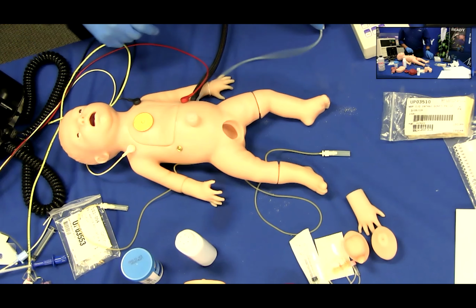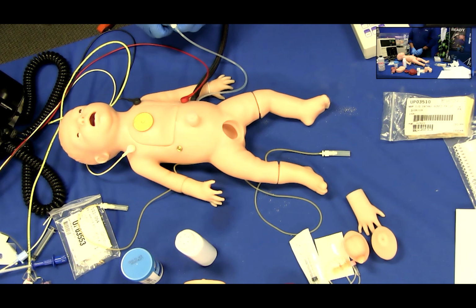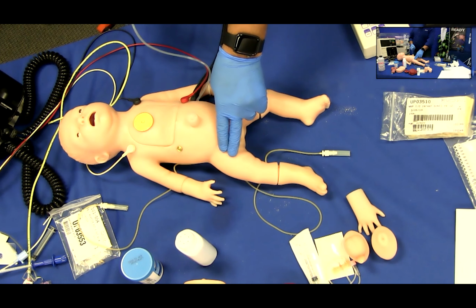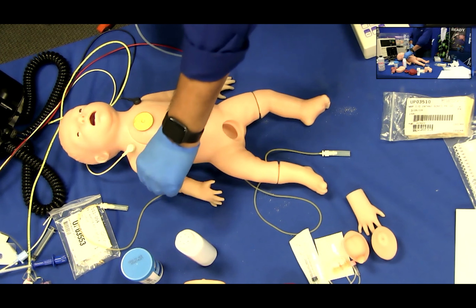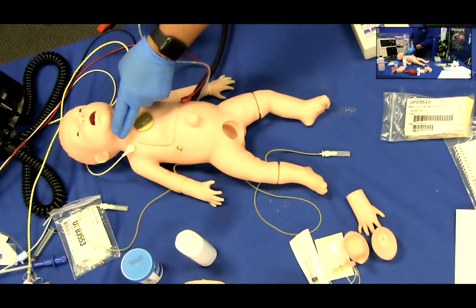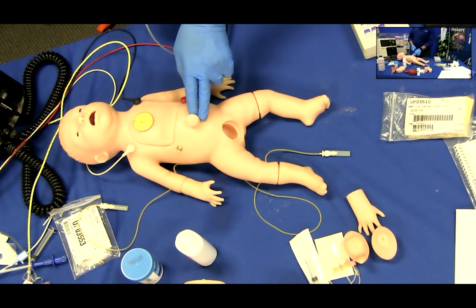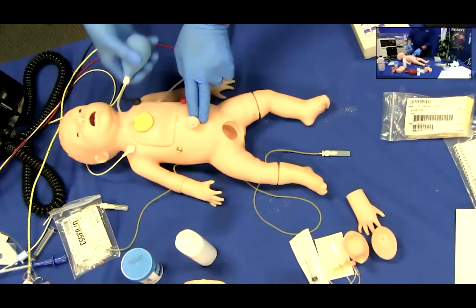Pulses. C.H.A.R.L.I.E features 7 functioning pulse sites: the right femoral, the left femoral, the right brachial, the left brachial, the right carotid, the left carotid, and the umbilical stump. The pulses are manual and can be simulated by attaching the squeeze bulb to the site and squeezing at the rate you select.